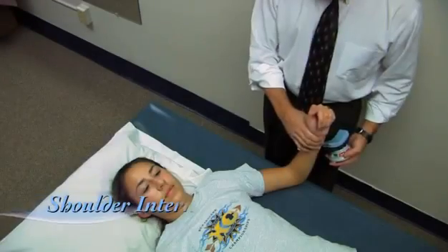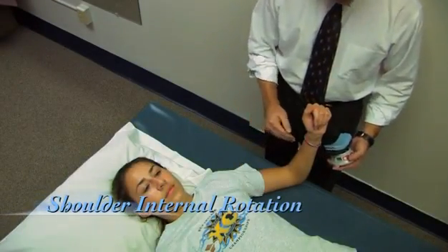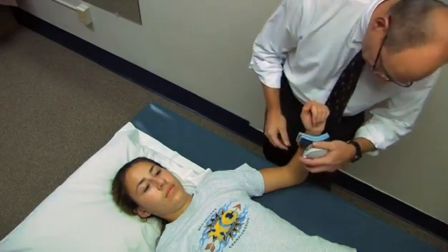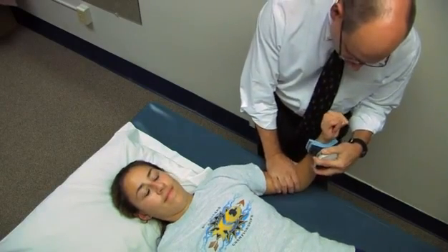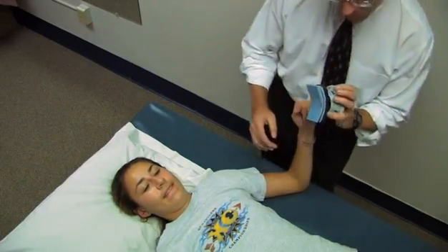Now we're going to measure shoulder internal rotation strength. Again, the shoulder is at about 45 degrees of abduction, the elbow is at 90 degrees. I'm going to place this just proximal to the styloids. Go ahead — roll it in, harder, harder. And relax. 28 pounds.